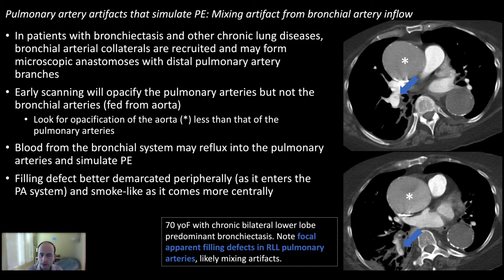Another cause of mixing artifacts within the pulmonary arteries is bronchial artery inflow. In patients with bronchiectasis or chronic lung inflammation, bronchial arteries hypertrophy. Remember, bronchial arteries are fed from the aorta, so their opacification is much later than the pulmonary artery system. In areas of abnormal lung, small collateral connections between the bronchial and pulmonary artery systems allow a shunt — flow from bronchial arteries into pulmonary arteries — causing small filling defects, as seen in this patient with bronchiectasis.